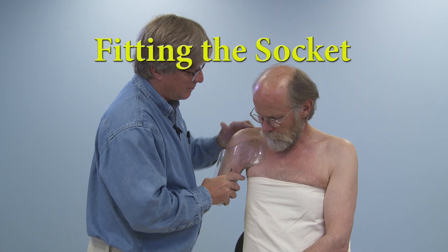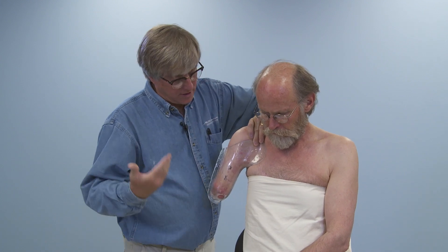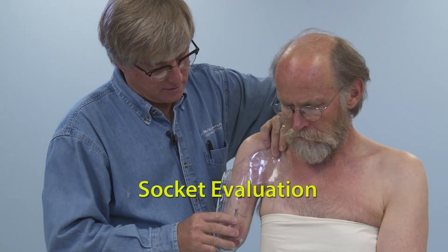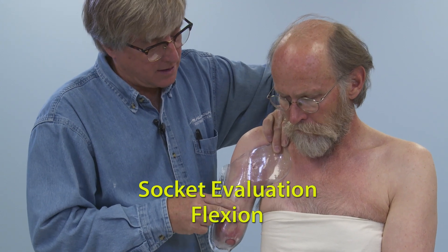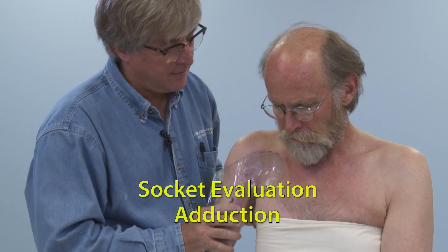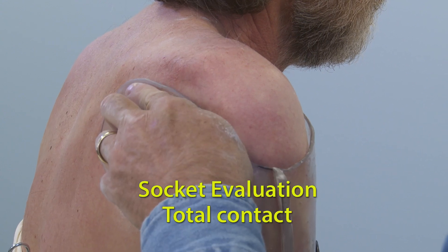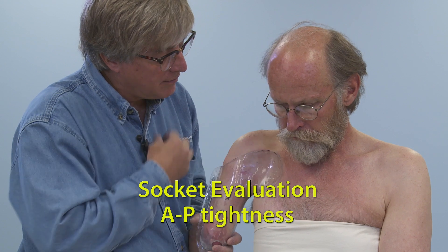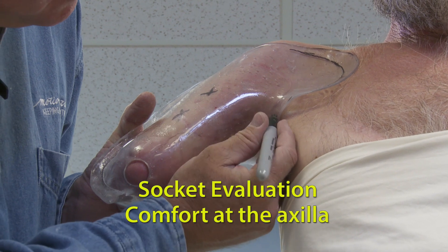Don the evaluation socket and hold the socket as the harness will suspend it. Evaluate the socket throughout range of motion — flexion, extension, adduction, abduction, and rotation. Check for total contact, patient comfort, impingement at the clavicle, AP tightness, ML tightness, and check for comfort at the axilla.